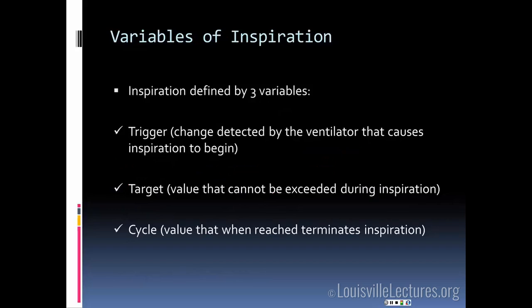So this part of the talk can be a little cumbersome because to some extent there is some memorizing to it, but I think it's important that you guys get familiarized with the terminology. Okay, so let's talk about variables of inspiration. So inspiration is defined by three variables.